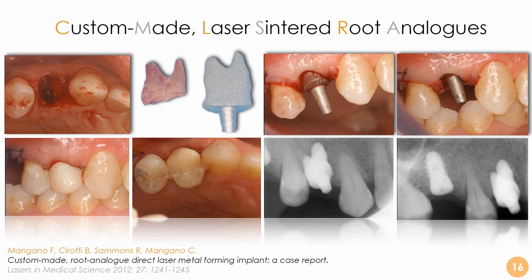It's really interesting what we can do with this technology, because probably the primary stability is not the one we expect, but anyway there's an excellent integration because of the power of the surface. The surface in this case is a porous surface, and this surface enhances bone integration. At the same time, the soft tissues seem to like this porous surface.